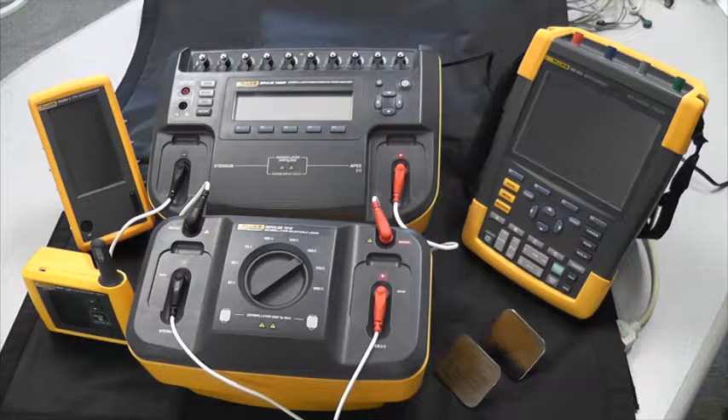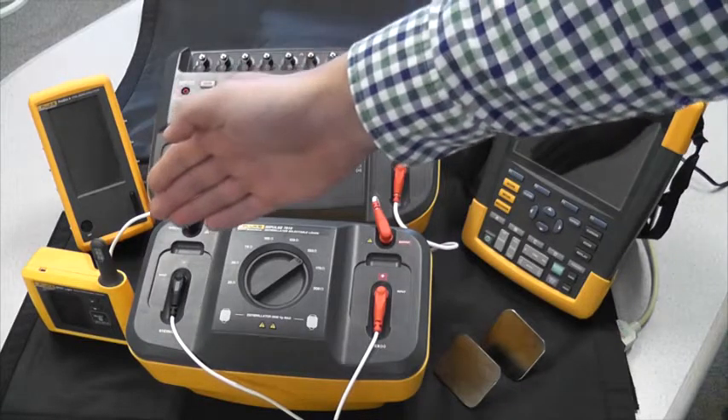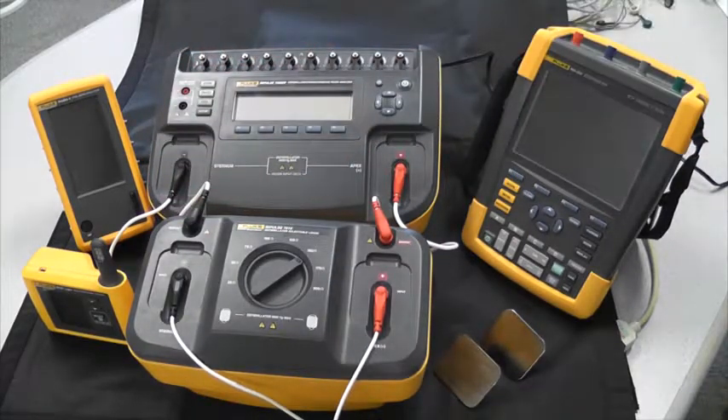There are also some high-end defibrillators that include more parameters than just defibrillation. For these devices, you may choose to use the Spotlight or ProSIM4 in order to test parameters such as NIBP, IBP, and SPO2.